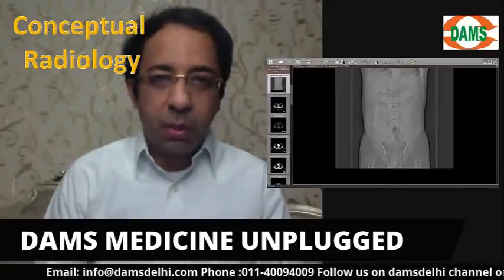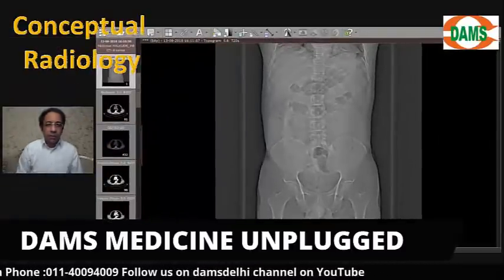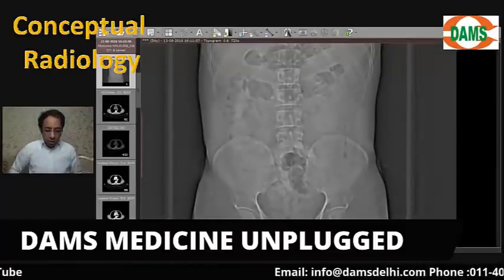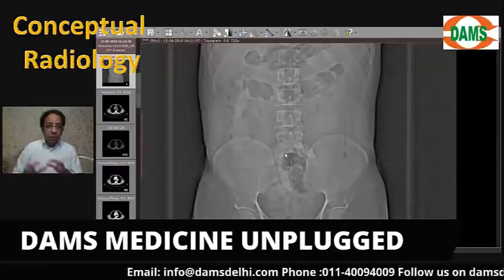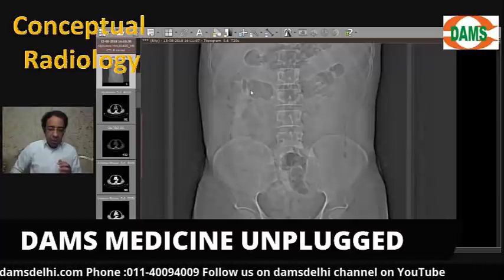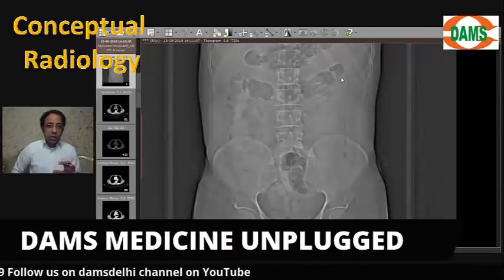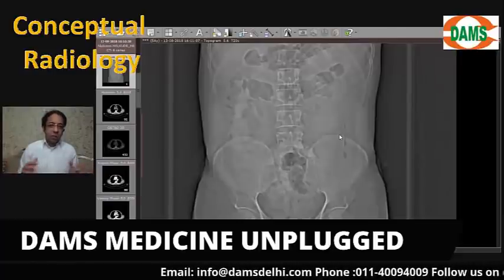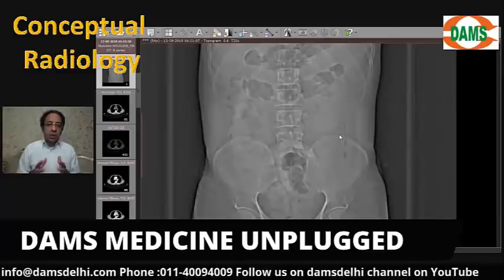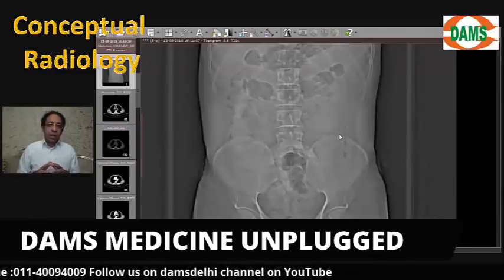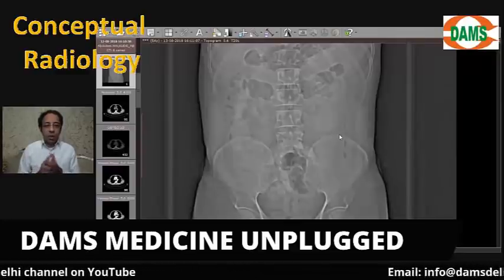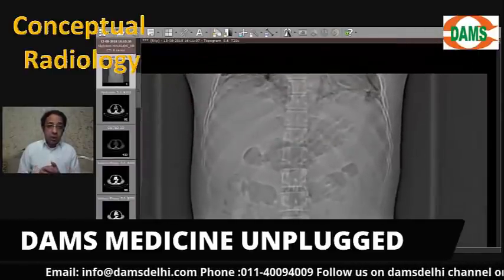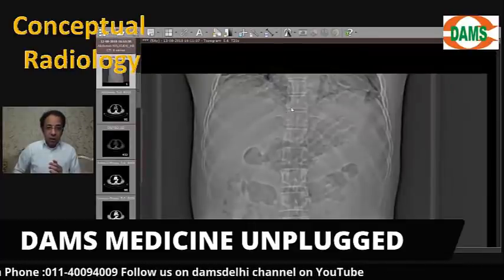Whenever we see a CT of the abdomen in a patient with abdominal pain, we always start by looking at the scout film. On the scout film you can see some localized dilatation of a bowel loop at the bottom, and the transverse colon appears gas-filled. After that you don't see any gas in the descending colon. There's no abnormal calcification or calculus visible, which we should always note. The vertebrae and iliac plates look fairly okay, and it's always a good idea to look at the lung bases on the scout film - the CP angles are not well defined here.